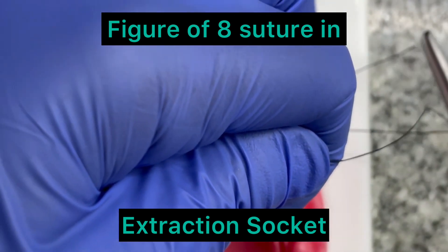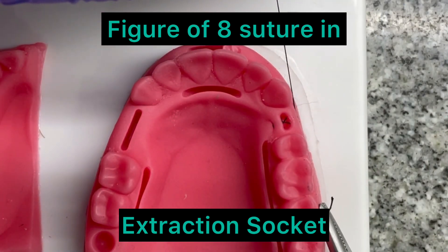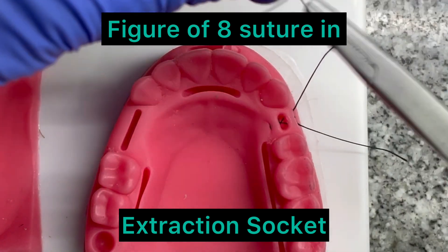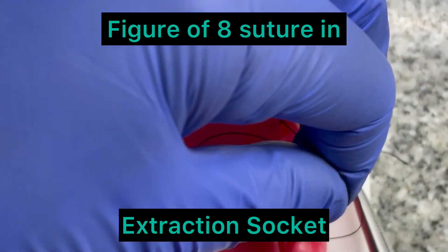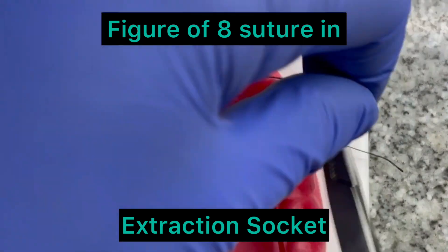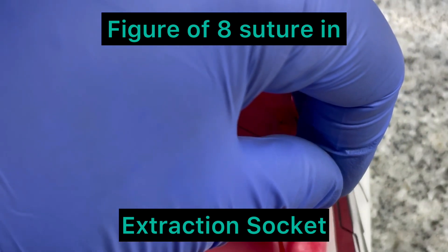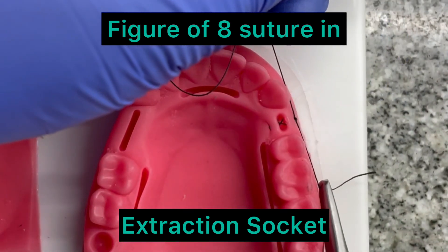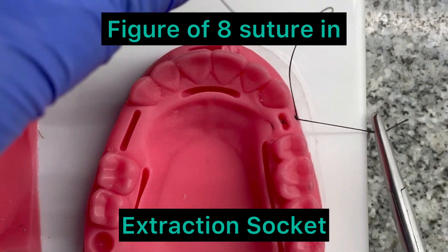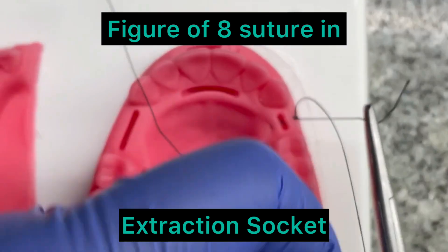I am going to put a knot here. The knot will be on the buccal side. It will provide slight closure but it cannot provide primary closure. A few extra throws are given. This is the figure of eight suture.